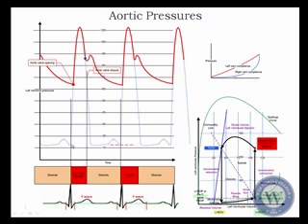Okay. This point, where I'm putting the arrow right now, is the mitral valve closure point. That's where you actually want to measure your pressures if you were to measure intraventricular pressures, as to the maximal point of filling of the ventricle before contraction takes place. From here to this red point would be your isovolumetric contraction phase, and that also will tell you the health of the contractility.